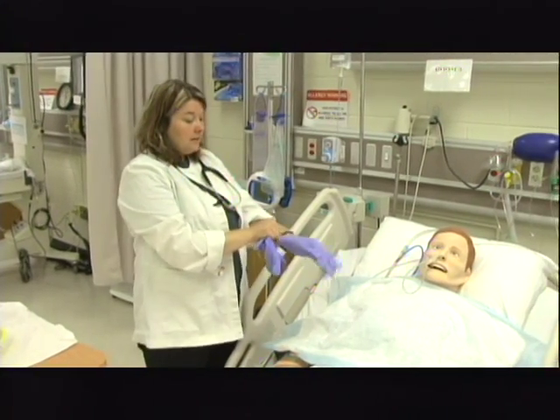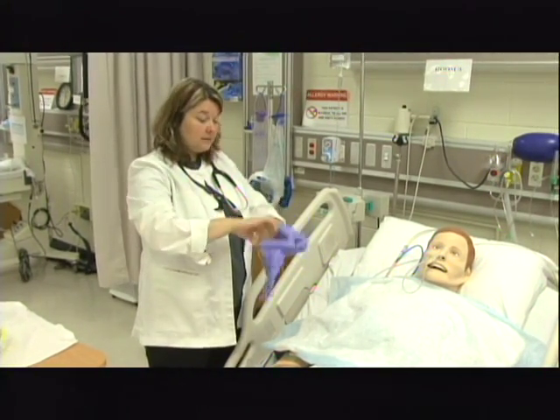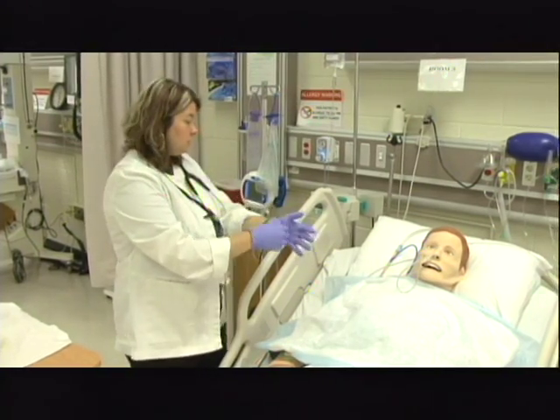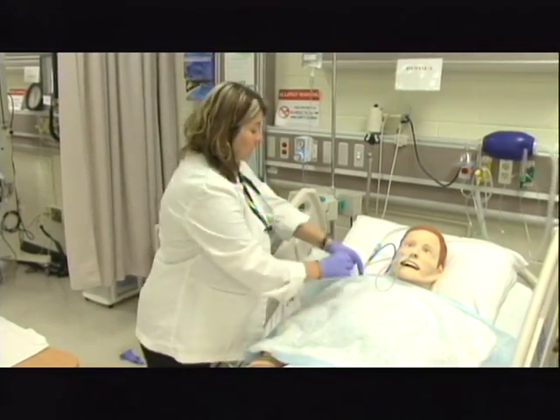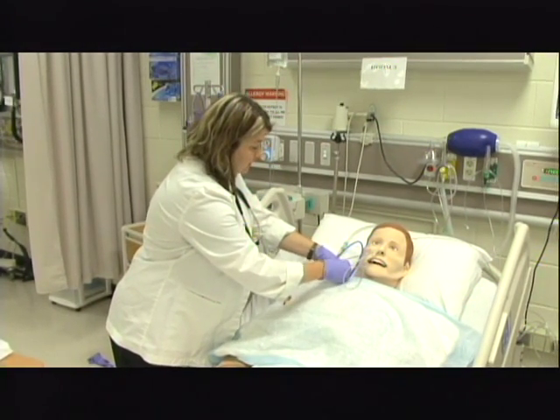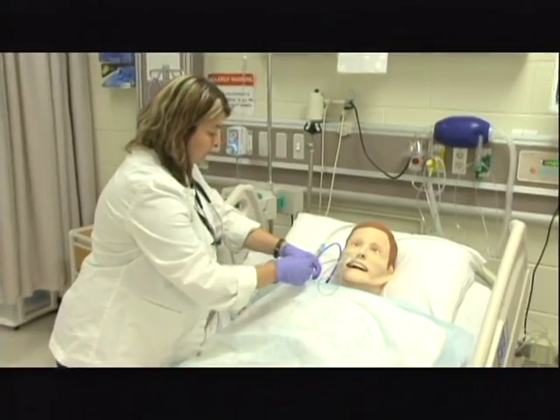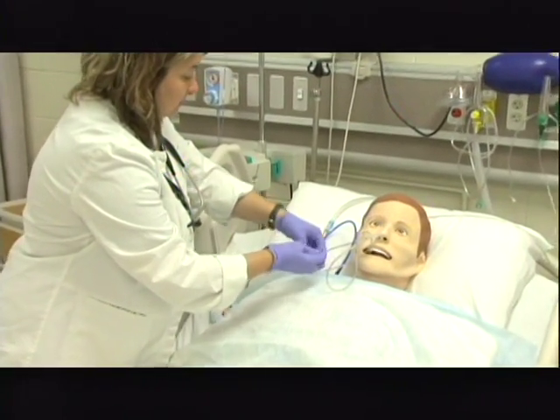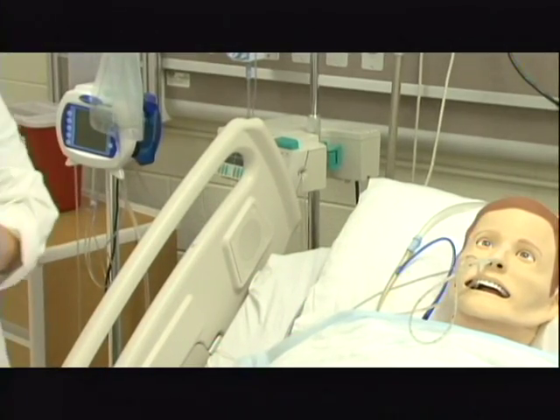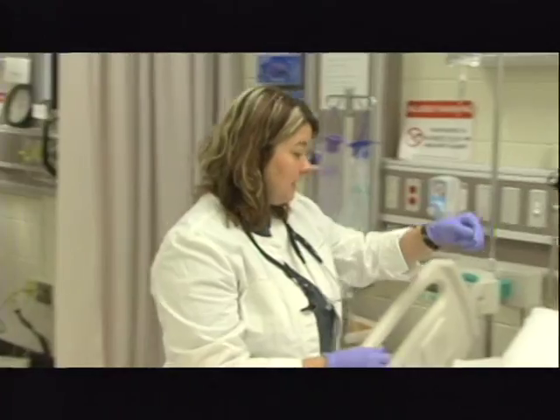I'm going to go ahead and come over here, and he actually has suction still going, so I need to disestablish the suction before I start. So the first thing I'm going to do is take the pin loose without pulling on his tube or irritating his nose. Go ahead and get this pin, and if it's coming out, we should be able to get rid of the pin, but please remember the pin can actually stick somebody, so you might want to get rid of it in the sharps box whenever you get finished.